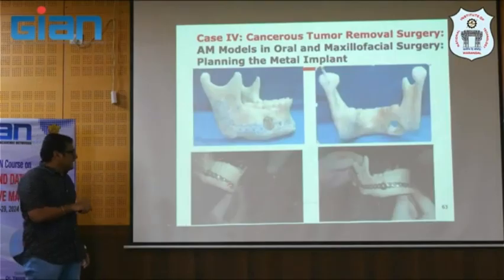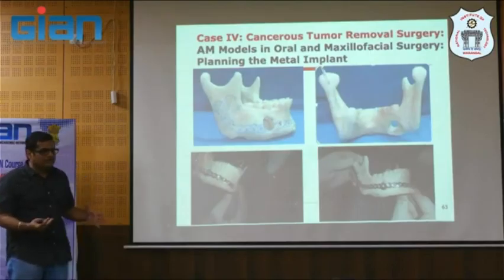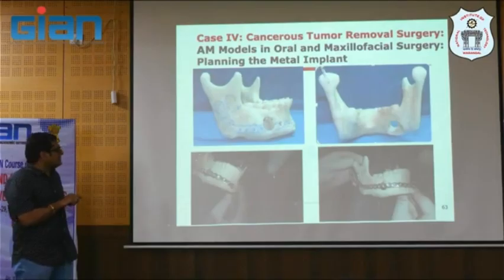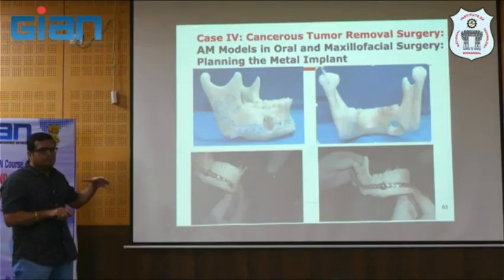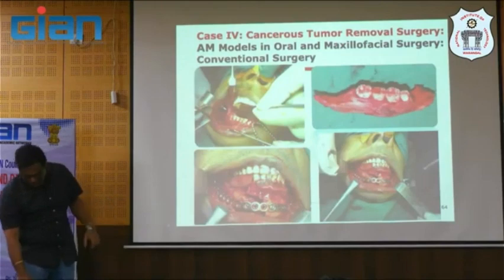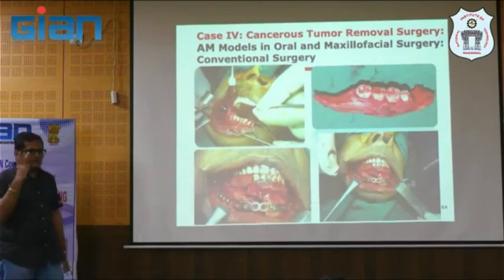And they will use these plates, but this is our first attempt to fix the implant into the patient body, but we could not do it. There will be several procedural things. But at least what we have done in this case is we have given these models for them to do, say, the steel or the titanium plates, they bend like this, and they will take a fibula bone here. So you have two bones here, from the knee to the ankle there will be two bones.